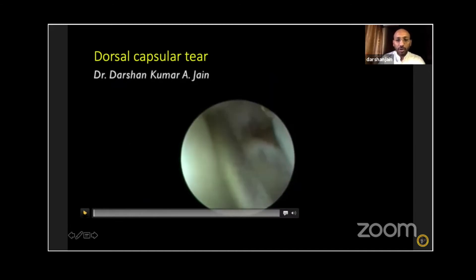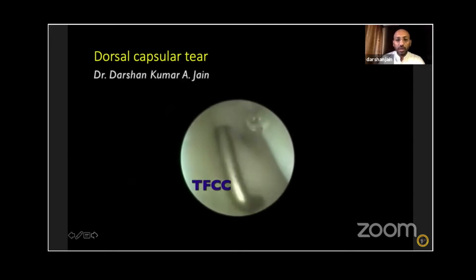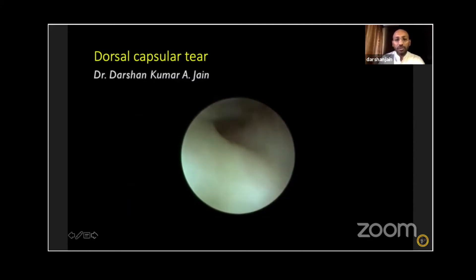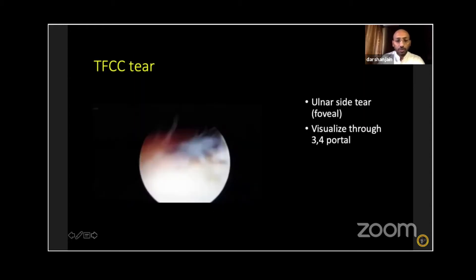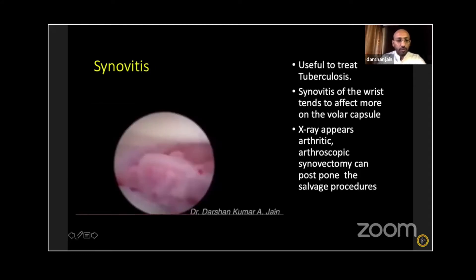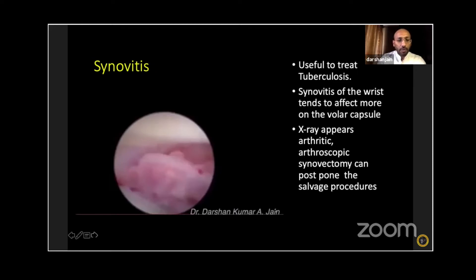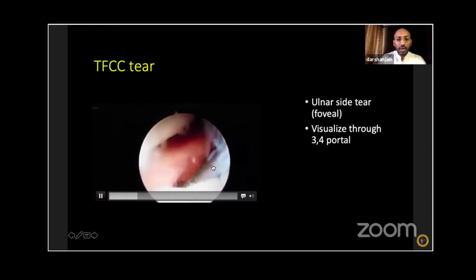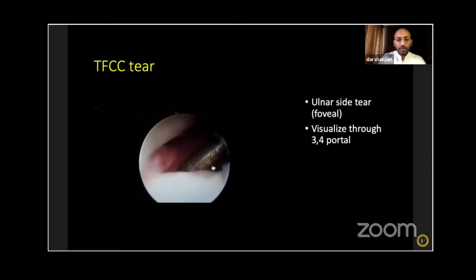There's another dorsal capsular tear visible here. You are viewing from the 3-4 portal and palpating from the 6R portal — that's the TFCC you're checking for the trampoline effect. This is a large tear on the dorsal capsule. On the foveal insertion side, you can see the tear on the ulnar side. This is a hook test demonstrating the TFCC, and you can easily do a lift-off on the ulnar side.